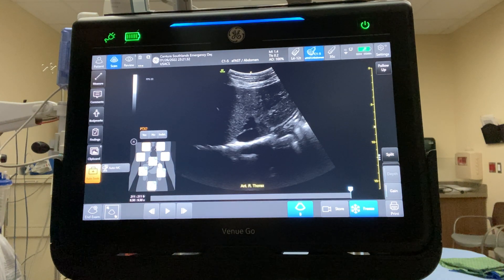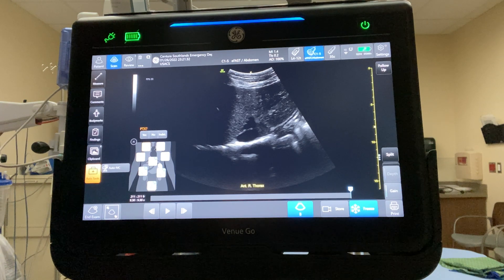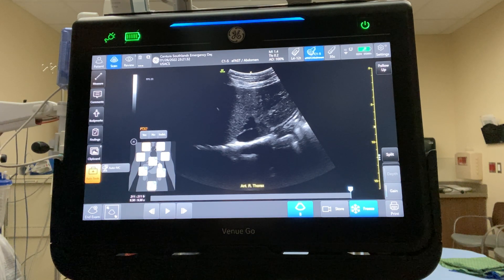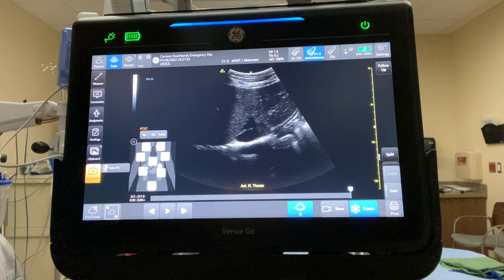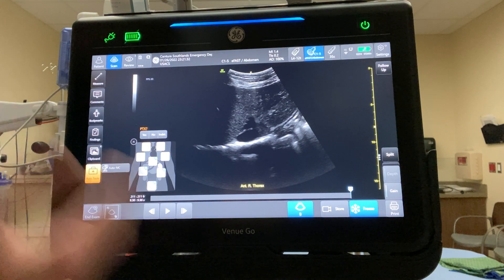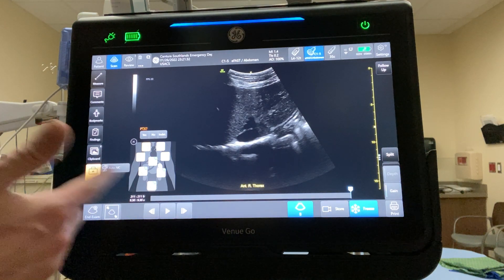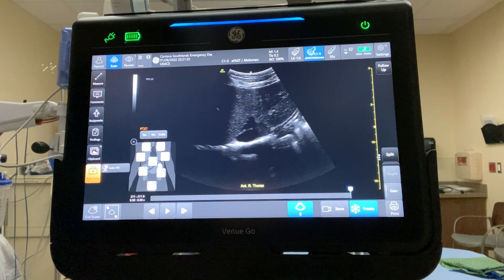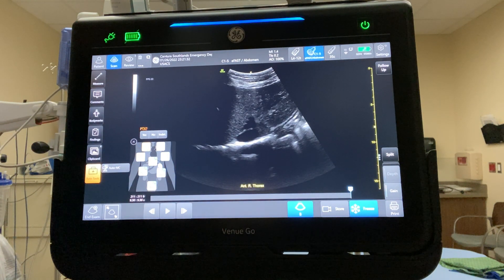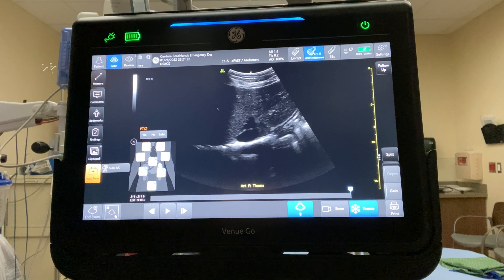So that's the FAST exam protocol. Protocols are really the future of ultrasound — clicking through different boxes so it automatically labels everything for you, and when people go back to review, they can see what image goes where without spending time labeling. It's another really cool feature on the new GE Venue Go.